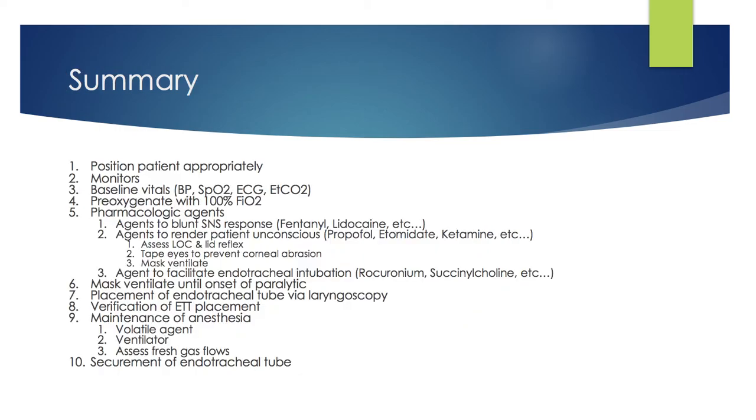So, to review, first, you will position the patient appropriately. Next, apply monitors. Next, obtain baseline vital signs, including blood pressure, SpO2, EKG, and end-tidal CO2. You will now pre-oxygenate the patient with 100% FiO2 delivered through a face mask.